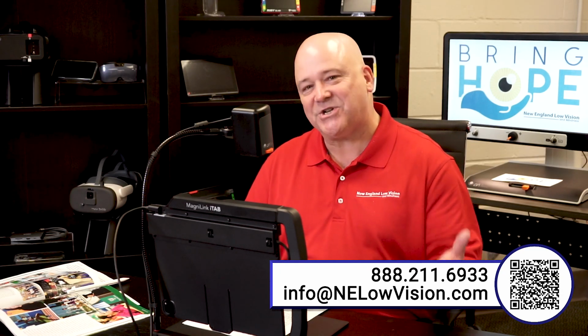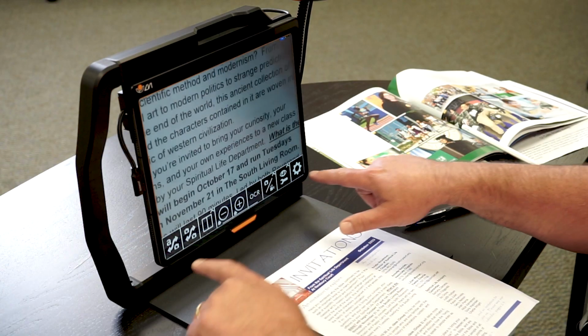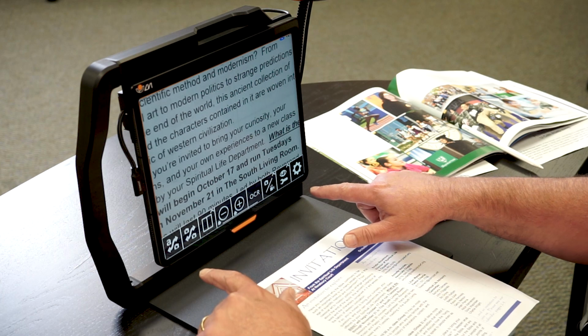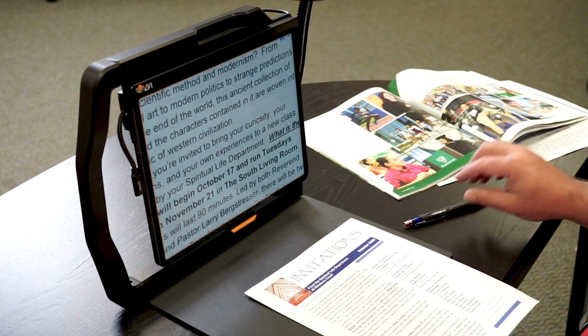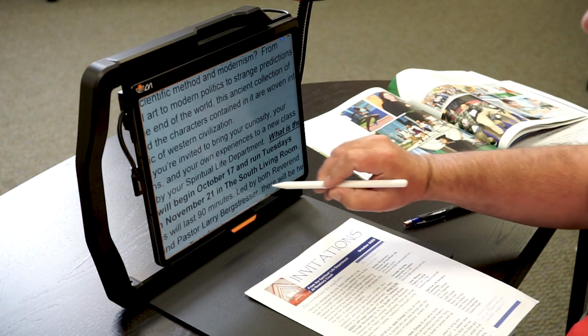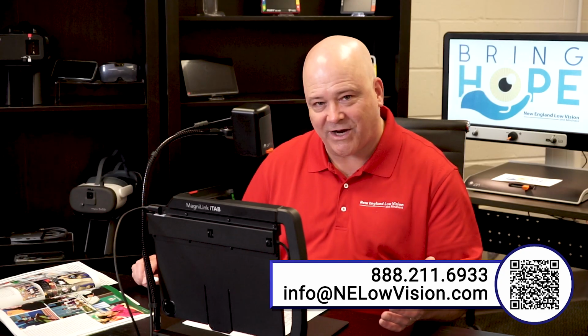If you don't like the gestures, then you can use keystrokes or you can tap on different functions within the menu that you see displayed on the bottom. At any point in time, if you want that menu to go away, double tap. Let's see if it works with my pencil. Tap, tap, so it either raises or lowers depending if you want it there or not.